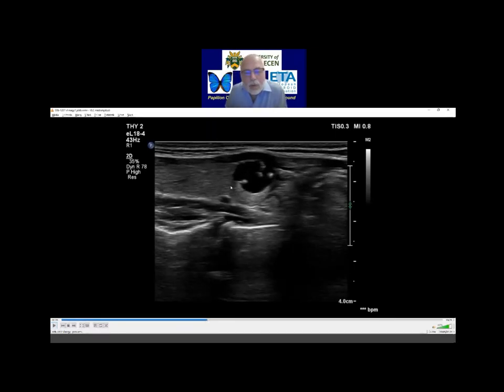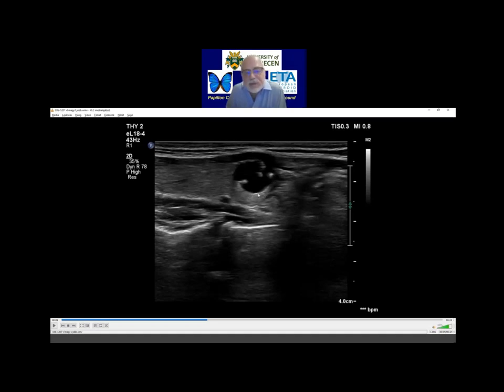One more consideration. This is the nodule and here you can see the solid part. This linear form corresponds to a back wall posterior enhancement figure, and this is clearly a peripheral type cyst. Here there are no solid parts, but at the dorsal part there is a quite large attachment to the inner wall of the nodule. So this is a peripheral type cyst.